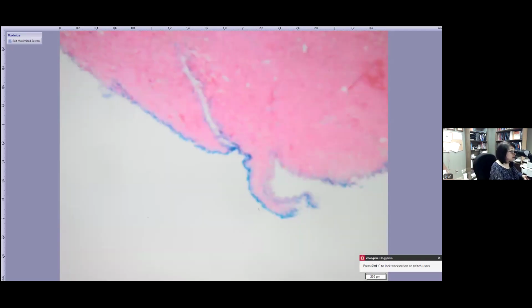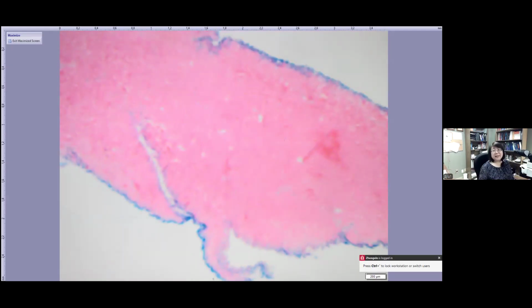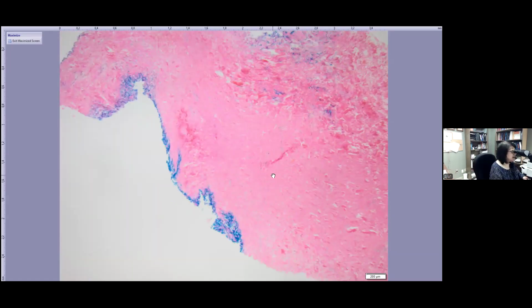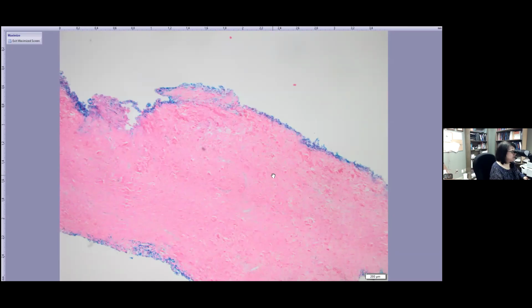So of course, serial sections. In the lab, we always ink. The blue is our ink. This pink area is our lesion. Multiple pieces here, low power view, that's similar. Pink. Very bland, very bland. Multiple pieces, they all look similar.